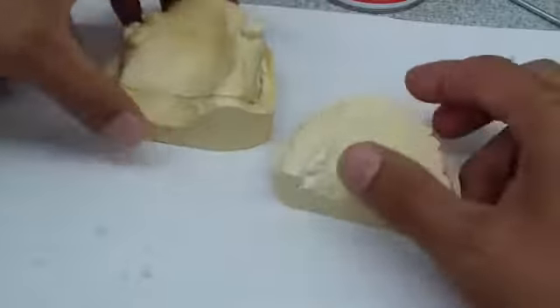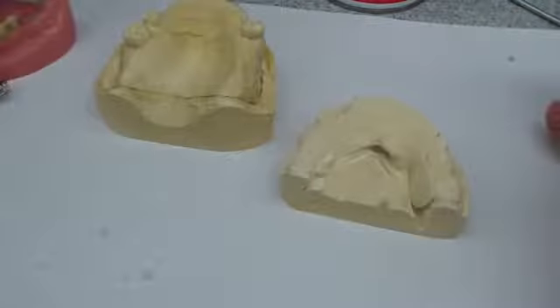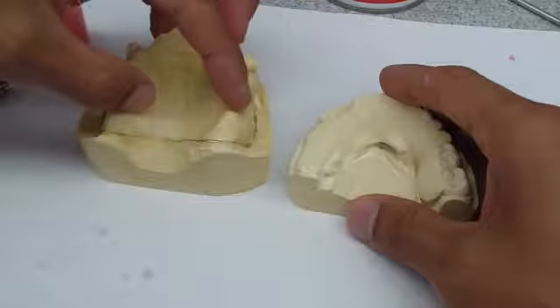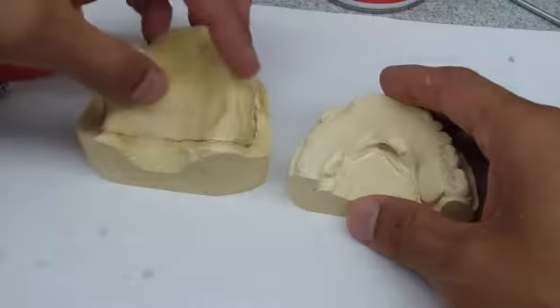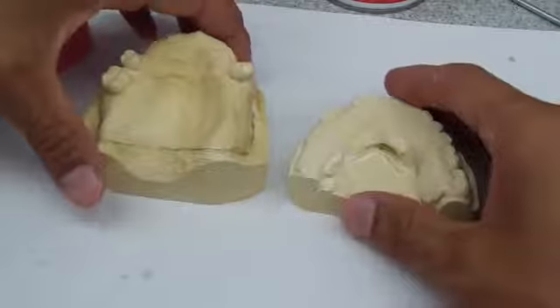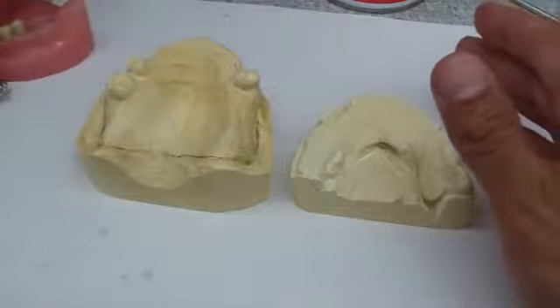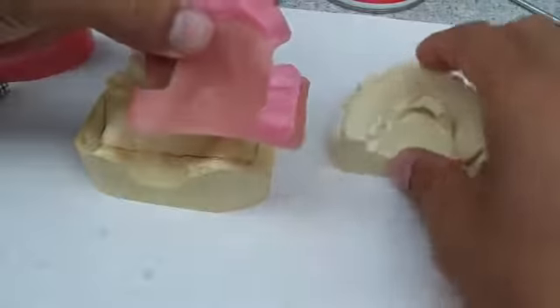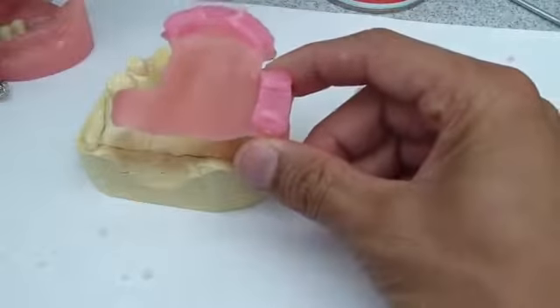In any event, just like complete dentures, we've captured our final impression. Now we need to capture a maxillomandibular relationship record, and there are a number of ways of doing that. And one way we've been taught is by fabricating a jaw relation record on denture base and wax rim.